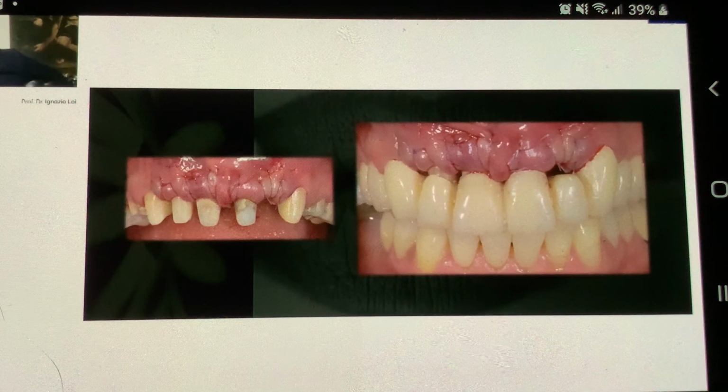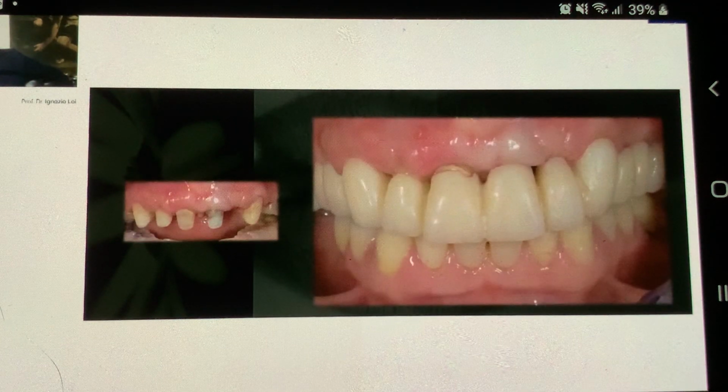This is actually the BOPT technique, and this is what allows us to manage tissues in a very simple way without doing resective surgery or big resective surgery. We had to do surgery here only to open a flap. This is a flap that allows us to see what was underlying without resective. So this is an exploration flap. We waited for the healing.